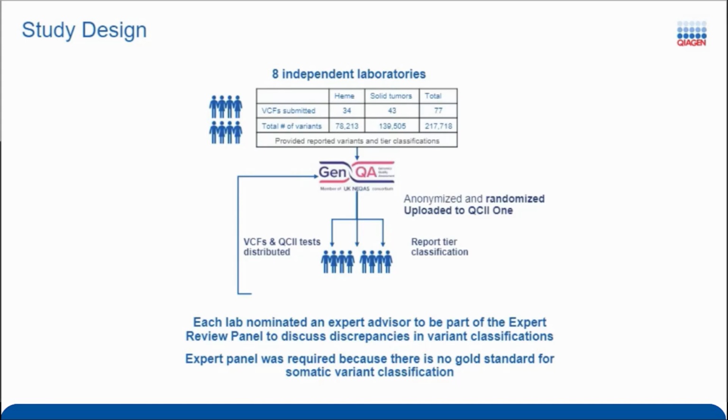And we sent them out to the eight independent laboratories, who then sent them back to us as anonymized, and we randomized them and sent them out amongst the other laboratories, and at the same time uploaded them to QCI software to do variant analysis.